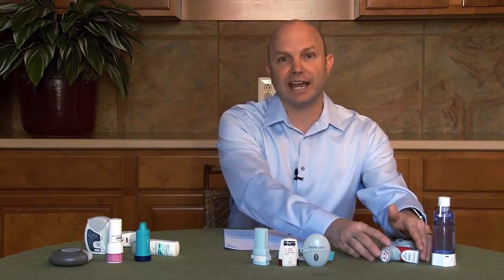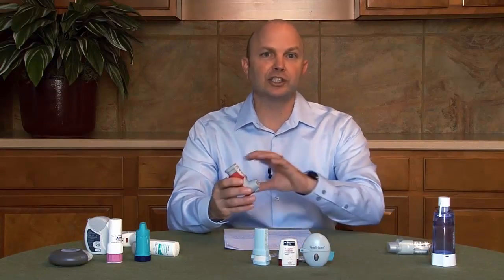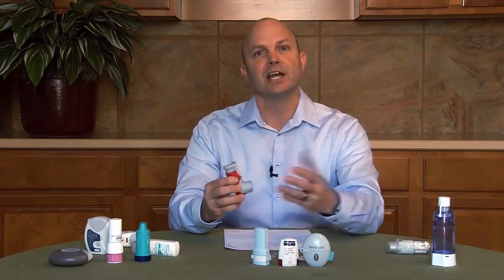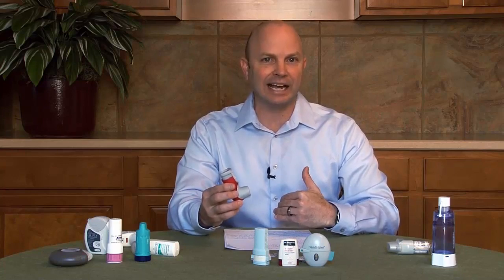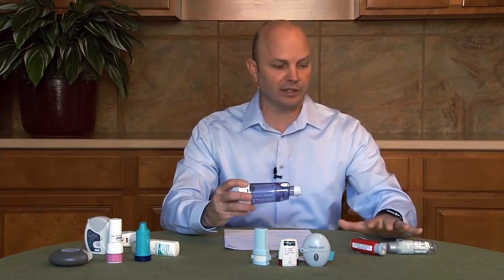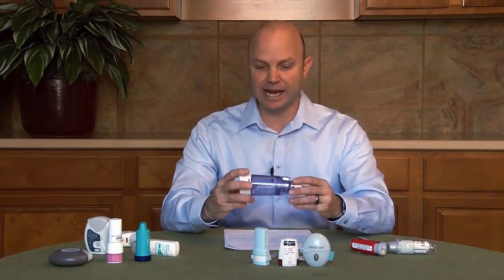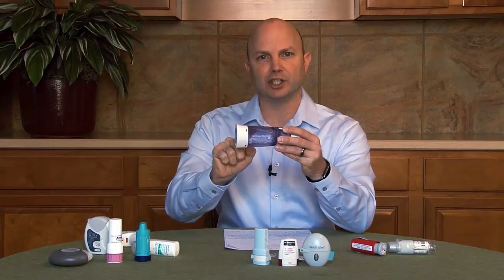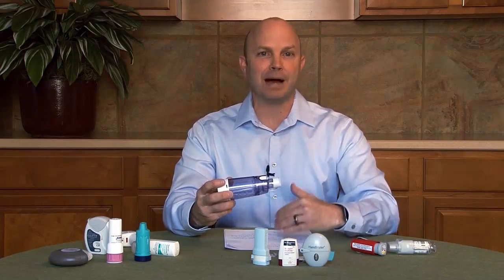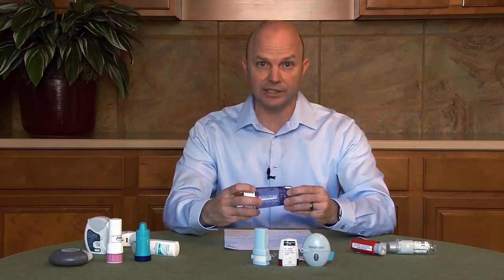The CFC inhalers are actually no longer produced today. So if you still have a CFC inhaler, talk to your doctor and get it replaced. The HFA inhalers are actually a slower, softer mist. And studies have shown that with the slow, soft mist, you get more medicine deposited inside your lungs. And valve holding chambers are also used with these inhalers. With pressurized MDIs, the medicine is suspended inside the chamber, and when you take a slow, deep breath into your lungs, you'll get more medicine deposited directly where you need it deposited.